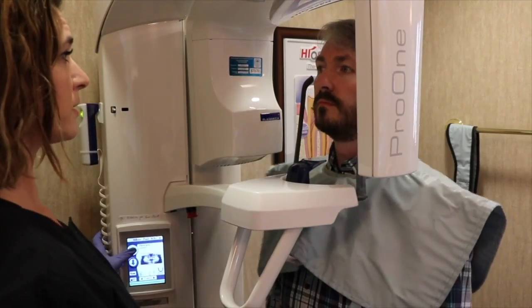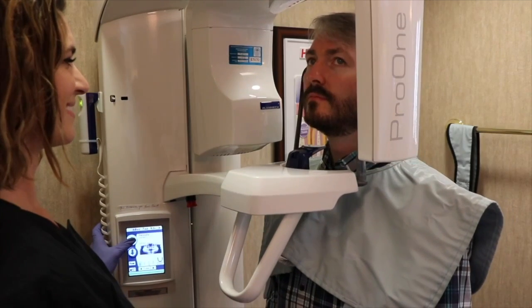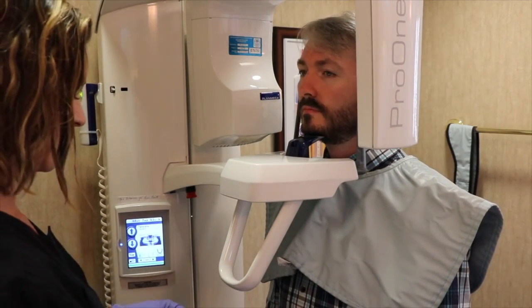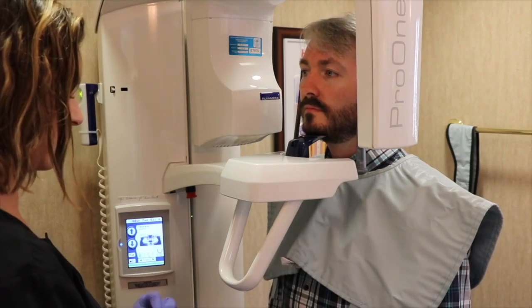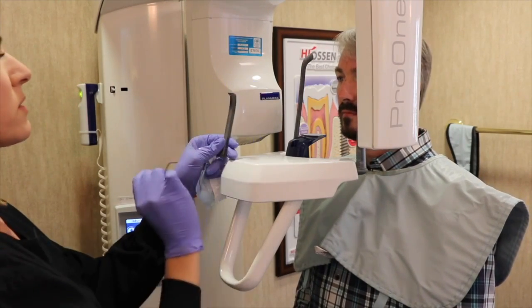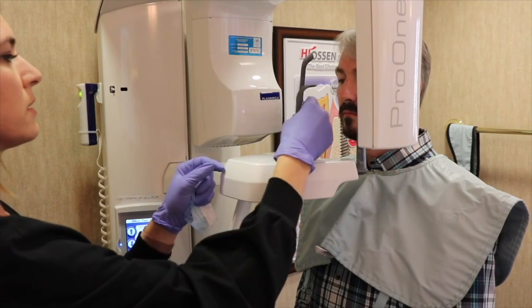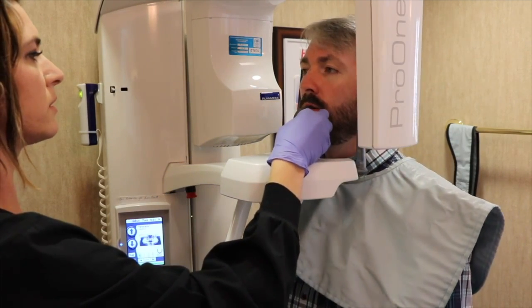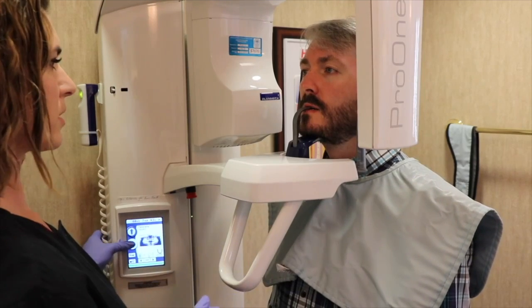Have the patient face the machine and eyeball the correct height. Ask them to stand nice and tall. This will help with hunching and also allow for shoulder clearance. I just line it up until the chin rest is about under their chin. Have them tuck the chin slightly or just ask them to rest it on the blue piece. I show them the bite stick and point out the notches for their front teeth. Then place the bite stick in position. Ask the patient to bite on the stick. Slight adjustments might be necessary.